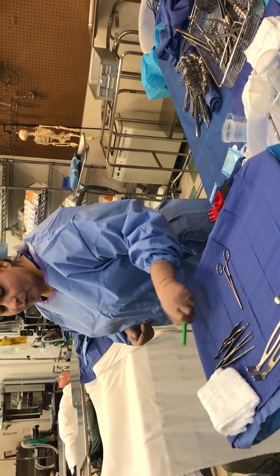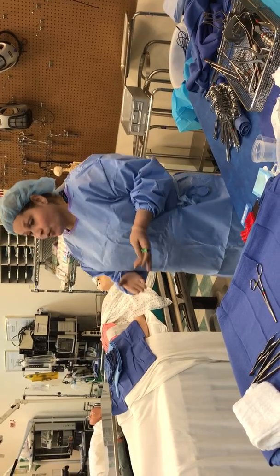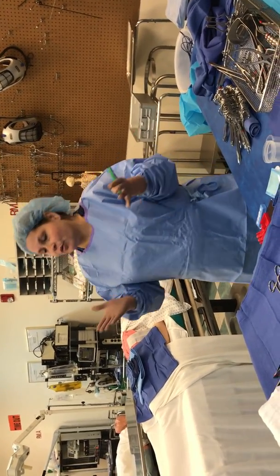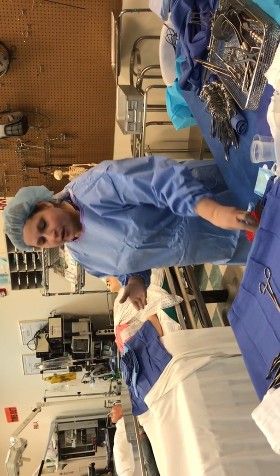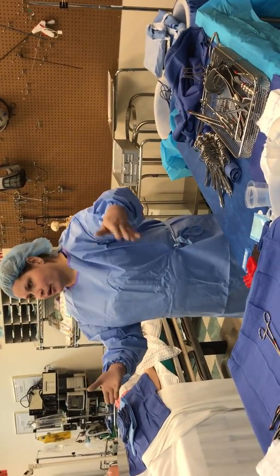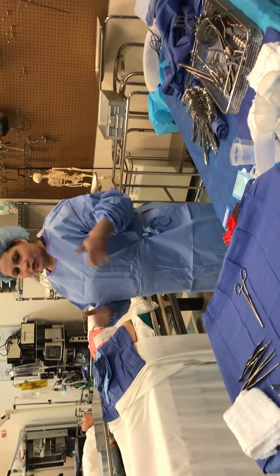What would I put in here? I would put two or three. So you have to think, what am I doing? Do I have a big case where I need a lot of instruments? You always start with the basics. Depending on what the doctor is working with, then you work your way up. Okay? You're not going to start with your whole tray on top of your Mayo if you're doing a huge case. Just start with the basics.